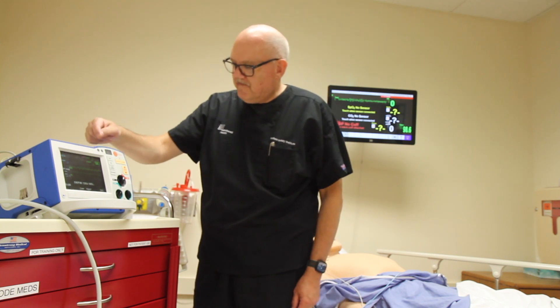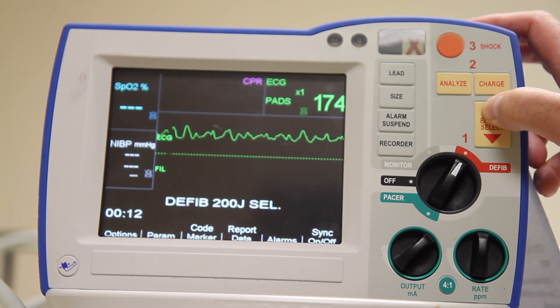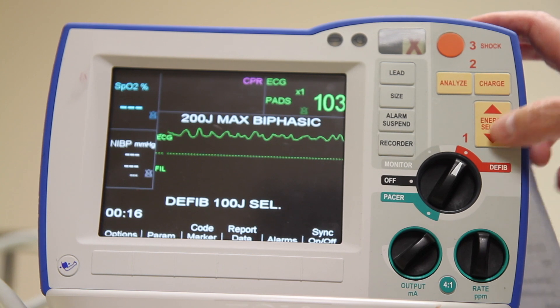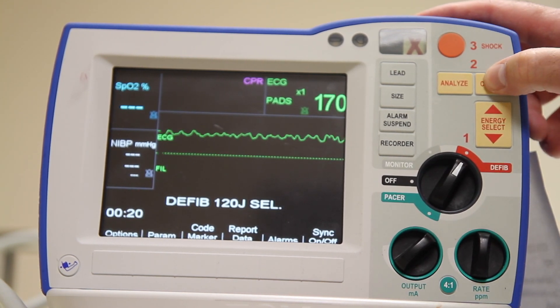I will analyze my rhythm, and my next step — step two — is to select an energy setting. This device defaults to 120 joules. If I want more, I press the up arrow. If I want less, I press the down arrow.